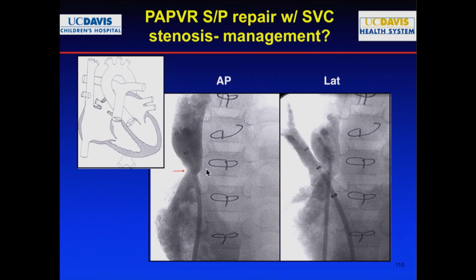You can compress the pulmonary vein, which is actually worse, right? So what you have to do is think about that. Know that in advance. We did a transeptal puncture, took a picture. Here's the veins. It's right next to that stenosis. Now, you have to ask yourself, if I inflate a stent there, am I going to obstruct this? I don't know that, so I'm going to do a balloon test first to make sure it's okay.